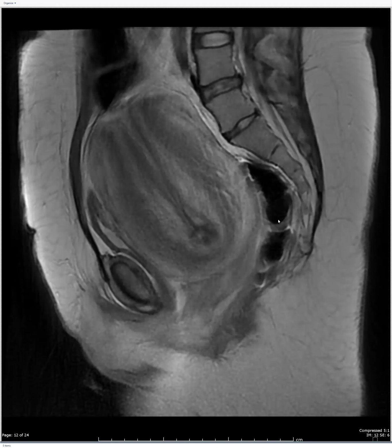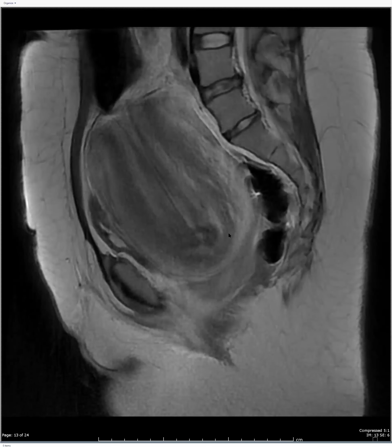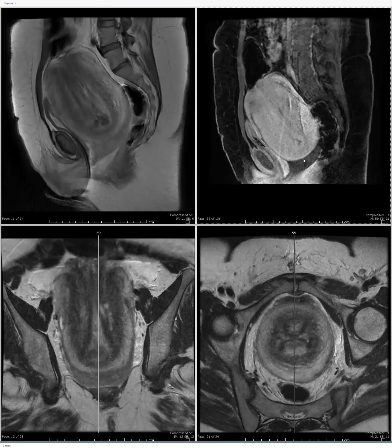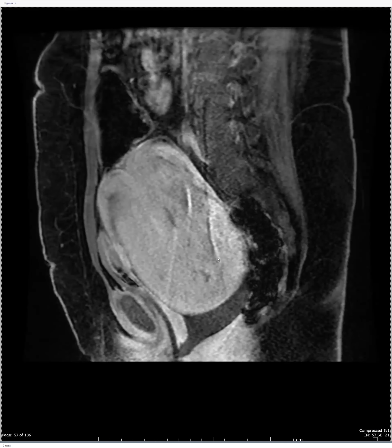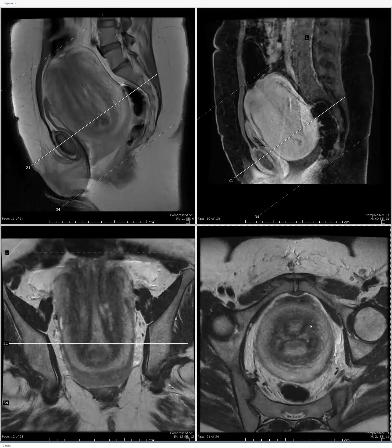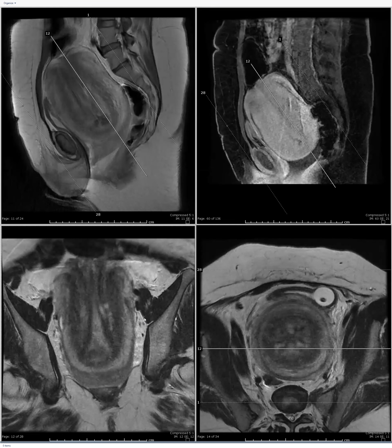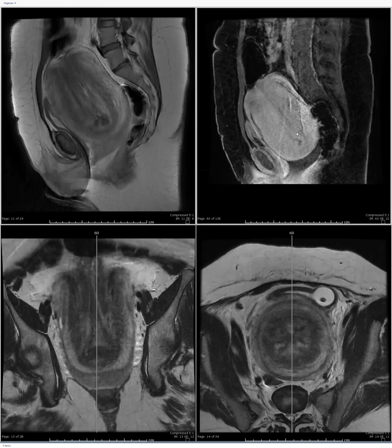I was talking to the OB who took this patient to surgery. Sometimes the inversion itself is not readily apparent on surgical exploration, and they do ultrasound or cross-sectional imaging for further evaluation. So I took her back to the OR. They initially, to preserve her uterus, tried to balloon reduce the fundus of the uterus back to its normal position. And they were successful, but if they were not, then the patient would need to have a hysterectomy to treat this. But yeah, very rare case. I think uterine inversion alone is very rare, but to see it on MR is also extremely rare.